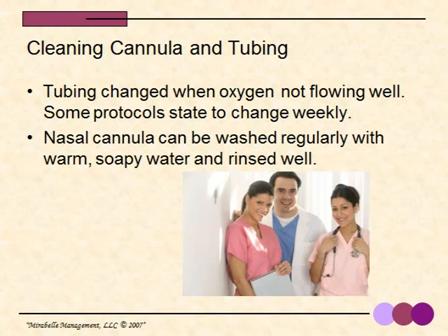Tubing is changed when oxygen is not flowing well, and some protocols state to change the tubing weekly. You follow what your site recommends. The nasal cannula can be washed regularly with warm, soapy water and rinsed well.